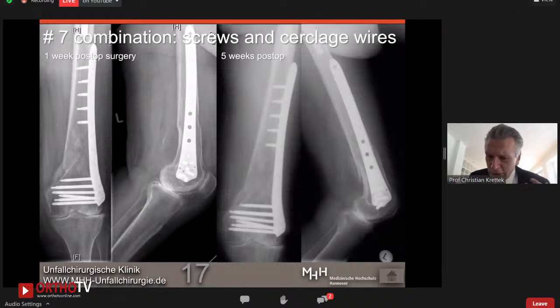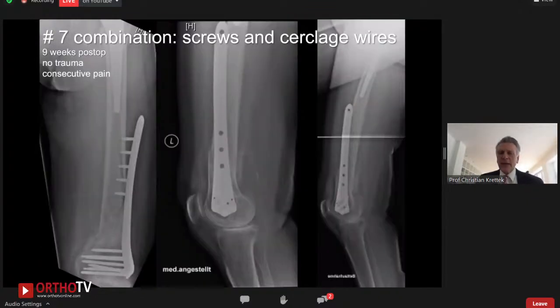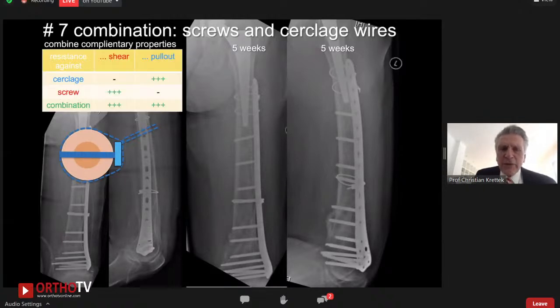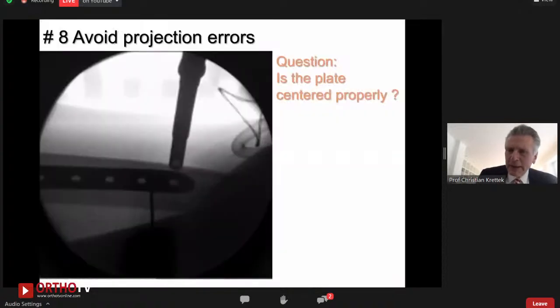Which made us also not unhappy yet, but when the patient showed up 9 weeks post-operatively, now with pain and some strange feeling, we see the plate has pulled out, as mentioned: bad pull-out stability, good shear resistance. And when it's combined with cerclage wire, this is the combination of the best of two worlds. The cerclage wire has poor shear resistance but good pullout resistance, and the screw has good shear resistance but bad pullout. So when we combine these two, we can reach the best of two worlds, and like here, the fracture healed uneventfully later on.